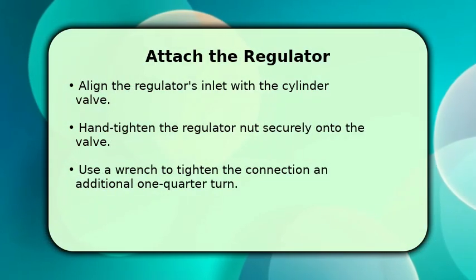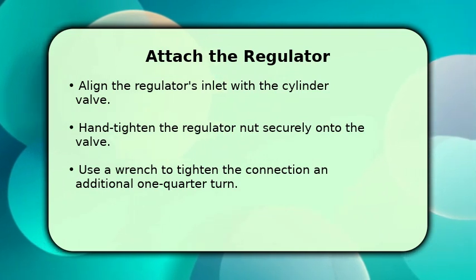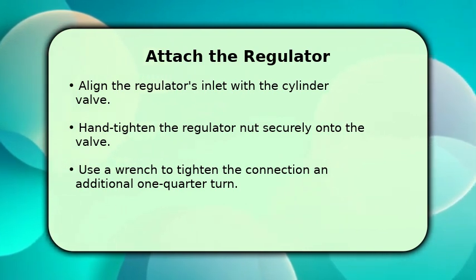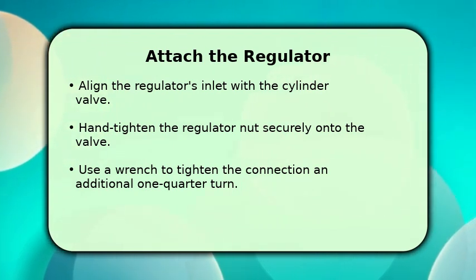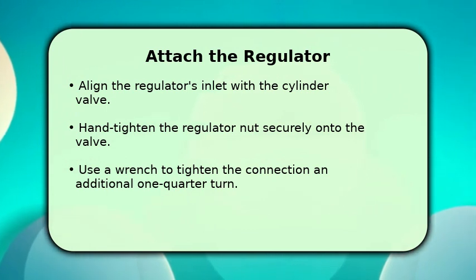It's time to attach the regulator. Carefully align the regulator's inlet connection with the cylinder valve. Begin by hand tightening the regulator nut onto the valve until it feels snug. Once hand tight, use the appropriate wrench to tighten the connection an additional 1/4 to 1/2 turn. Do not over-tighten, as this can damage the seal. A secure, but not excessively tight, connection is key.